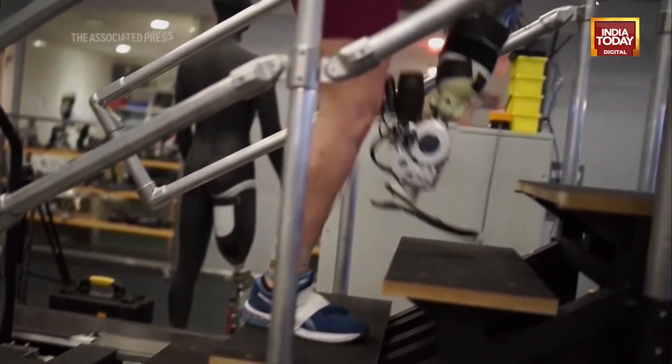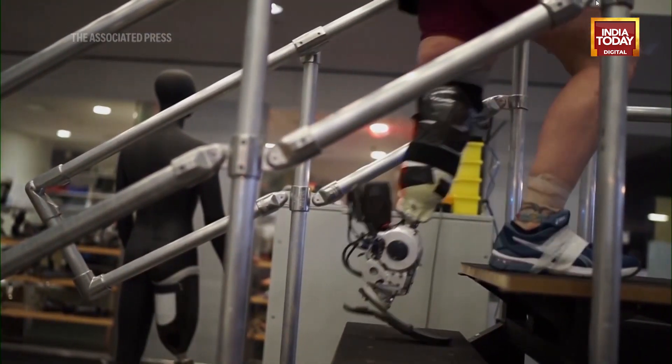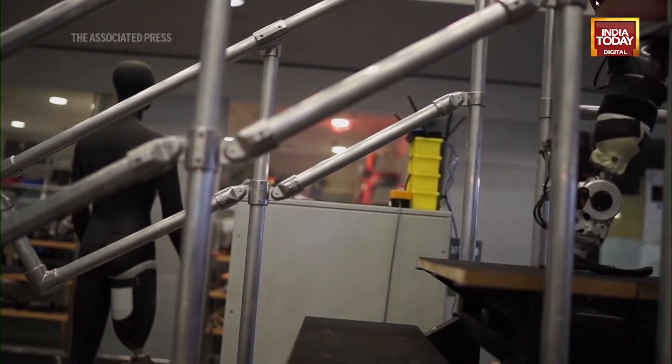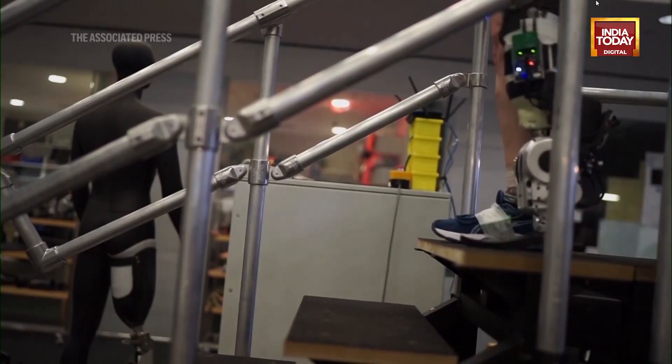This is a prosthesis where all the movements and the forces that it applies on the ground — all the kinetics and kinematics — are really dictated by the person, by their spinal cord and their central brain. And that's fantastic because the person can decide what they want.